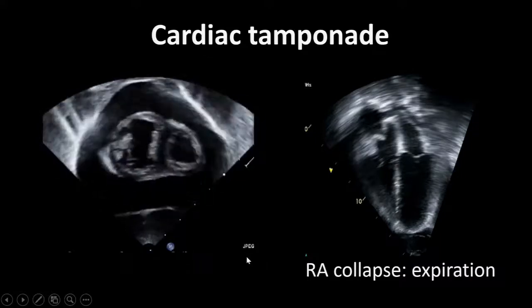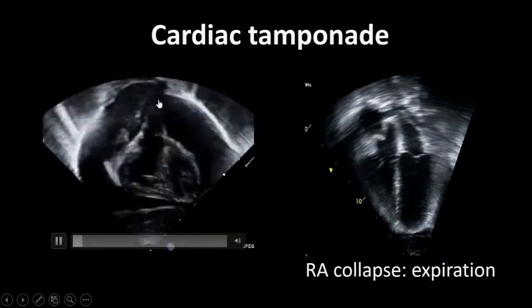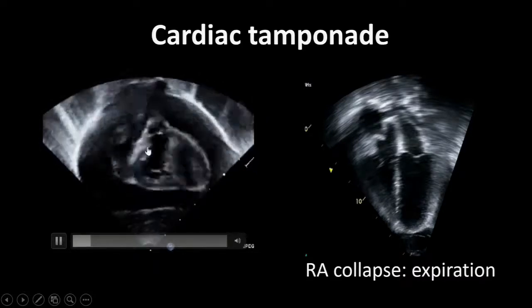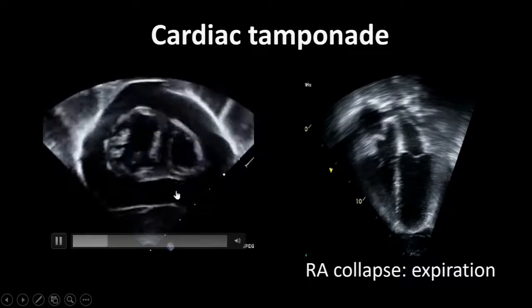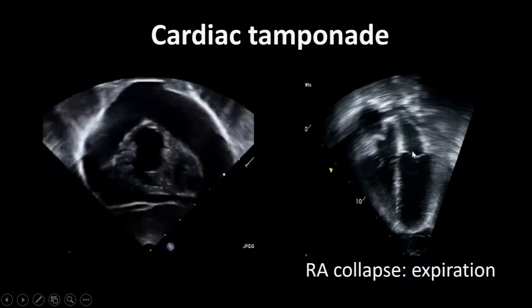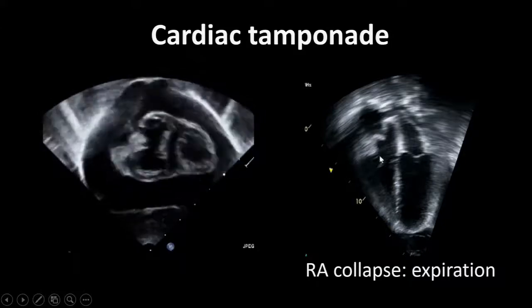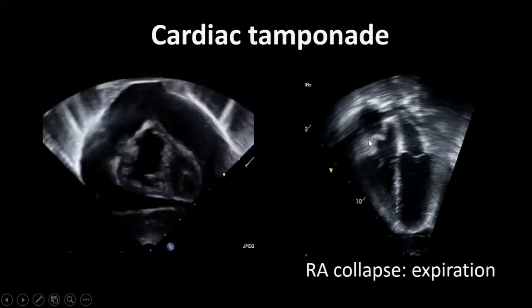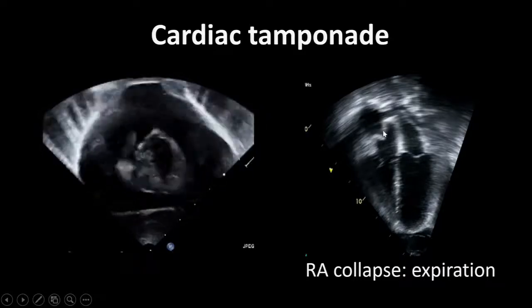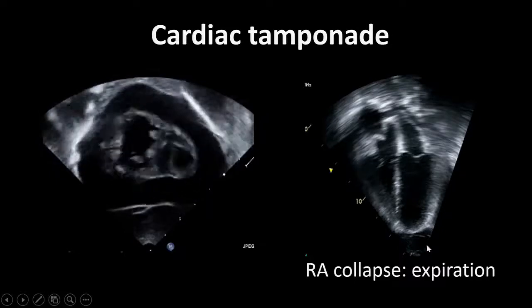Example of cardiac tamponade, okay, large effusion, not subtle. Okay, here's a heart banging around that can lead to alterations in the voltages on EKG. And here's an example of what you can see in tamponade physiology, where here's the right atrial wall. Normally it would have a contour like this, but you can see right atrial wall collapse. It's bowing into the right atrium during expiration.